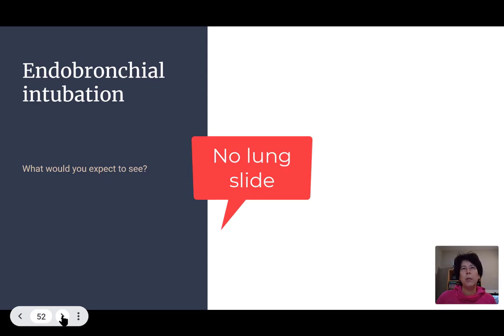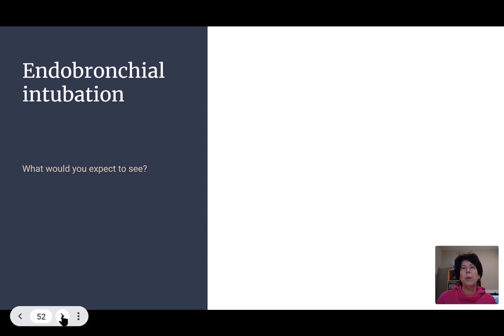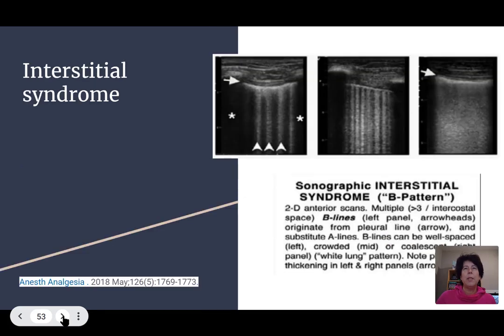You would still see lung pulse. You'd still see A lines. You'd still see B lines potentially. And the M-mode would still probably be fairly normal looking. If there's some lung pulse, you'd still have that motion that would give you that clear line. So really, the only absence would be a slide on the side that's not being ventilated, so opposite from where your tube is gone.